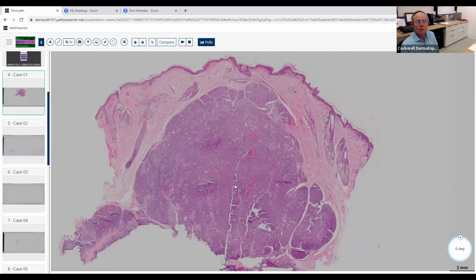Keep a little red flag flashing in the background. This is almost certainly benign, but just remember that occasionally a nodular metastasis of a neoplasm can give you an architecture that looks benign, but it's really malignant. But you're right. This is going to be benign.